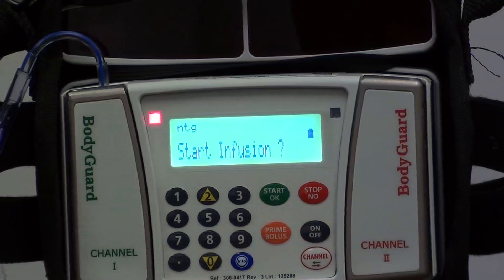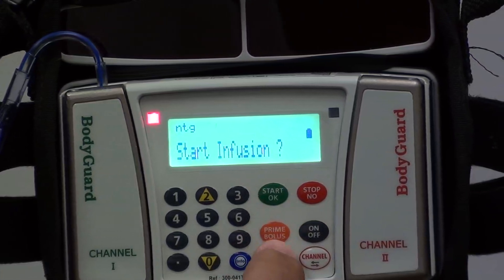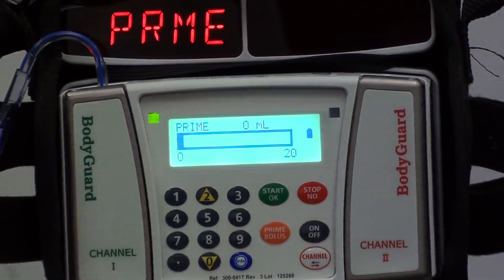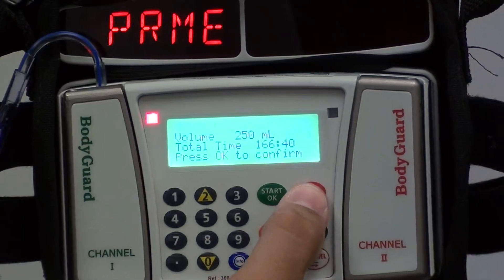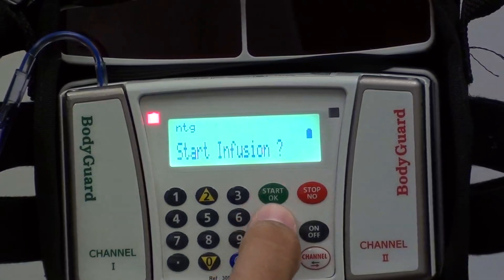You'll need to prime the tubing. Press the prime button and hit OK. You'll let this go until all of the air and bubbles are out of the line. Once that's done, press the stop button and then go back to the standard infusion by pressing OK.